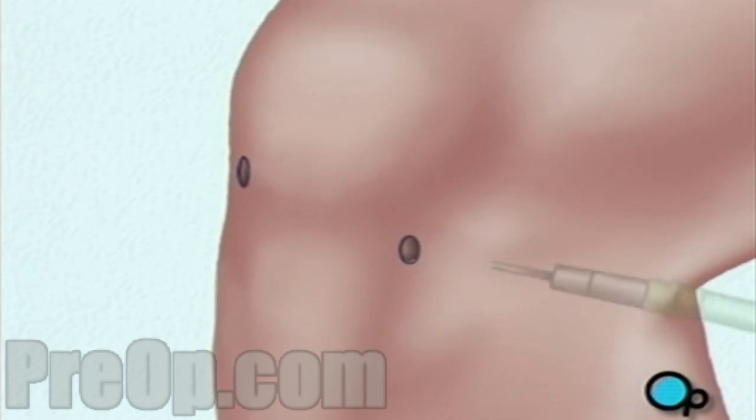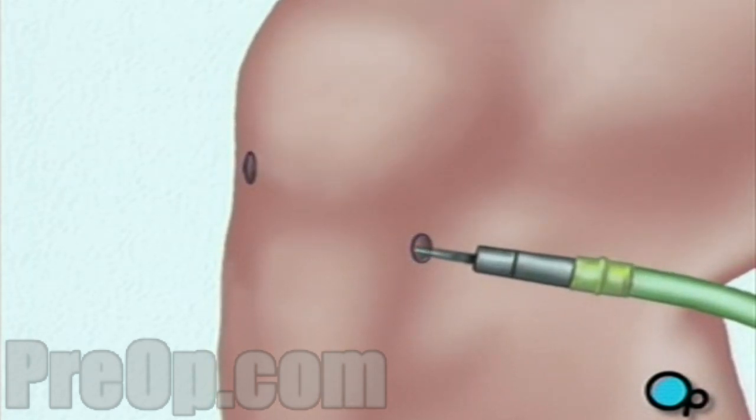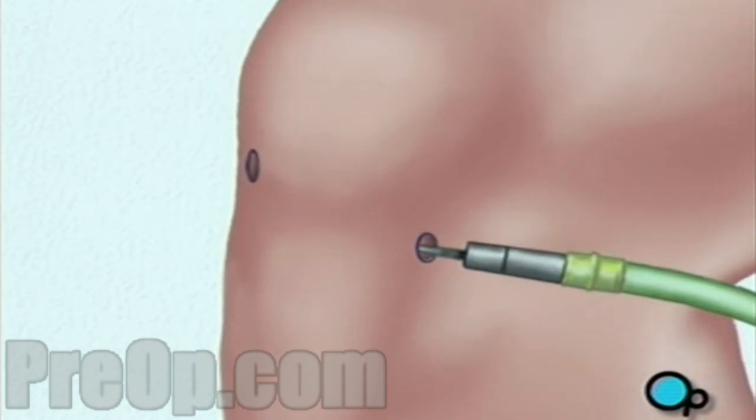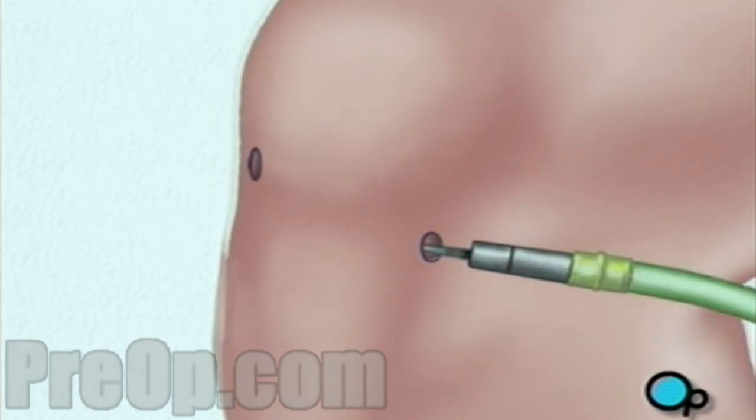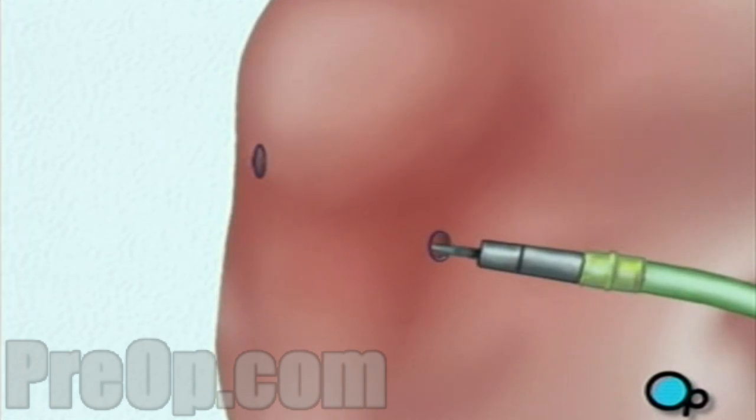Before your doctor can insert the arthroscope, the surgical team must inject a clear fluid into the joint. This fluid will inflate the interior space and will help your doctor by providing an unobstructed view and enough room in which to work.